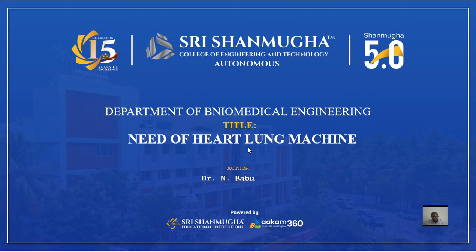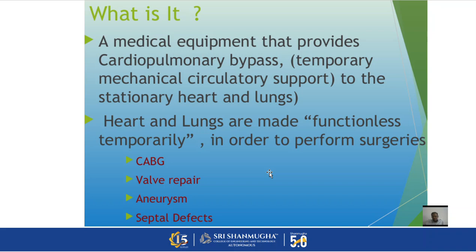Heart-lung machine we have seen in the hospitals. So, we have to discuss what a heart-lung machine is. Before that, we have to know the need of the heart-lung machine, and which patients need the heart-lung machine. Okay, in this diagram, what is it?